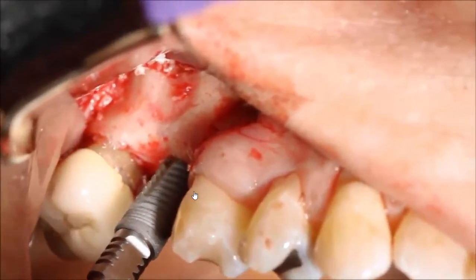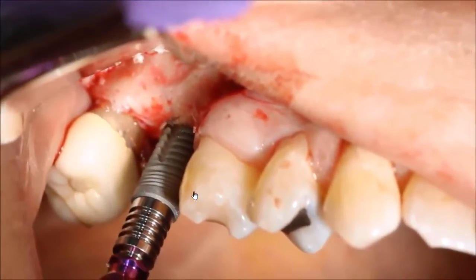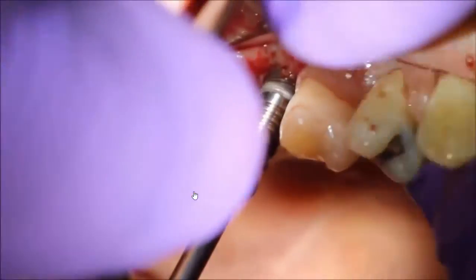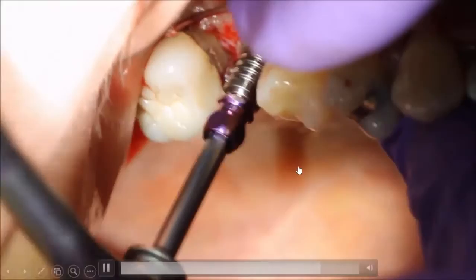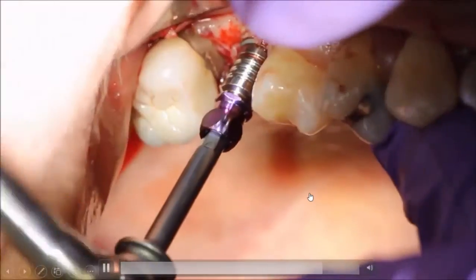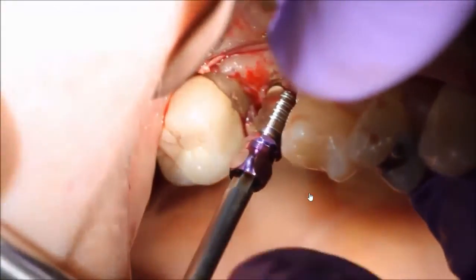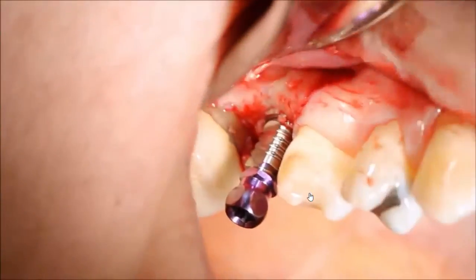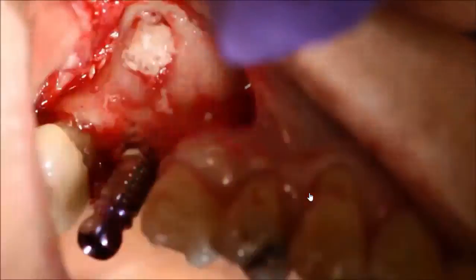لما نحط البون جرافت بالأوستيوتومي وبندفش البون جرافت بالزرعة we want to make sure that the implant will be surrounded by bone graft. هلا مثل ما شايفين we have high torque with the implant placement. We achieved good primary stability. وبعدين طبعا بنحط bone graft on the lateral aspect of the implant. We continue to pack bone graft as we see here.